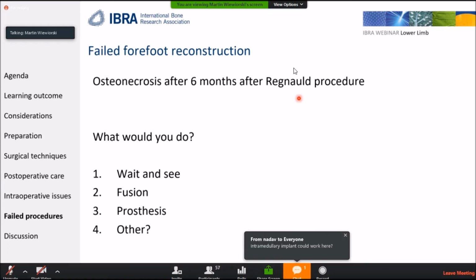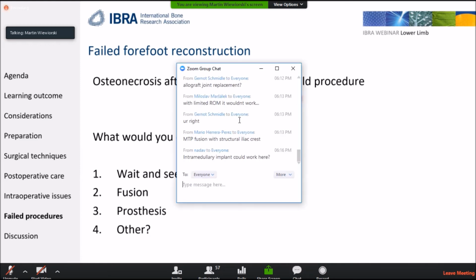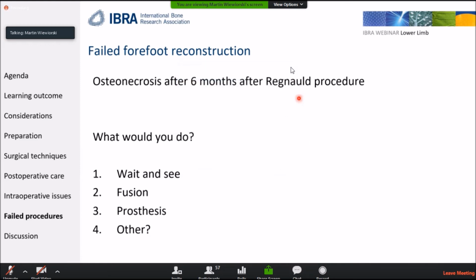But it's not something which I would try to control intraoperatively by placing K wires like in the cuneiform and the metatarsal to actually correct for those deformities. I think that the Lapidus corrects itself, and the scarf osteotomy is also not such a big issue. But this is my opinion.